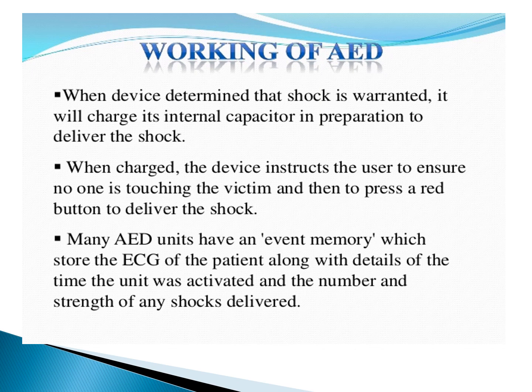When the device determines a shock is warranted, it charges its internal capacitor in preparation to deliver the shock. When it is charged, the device instructs the user to ensure no one is touching the victim, and then to press the red button to deliver the shock.